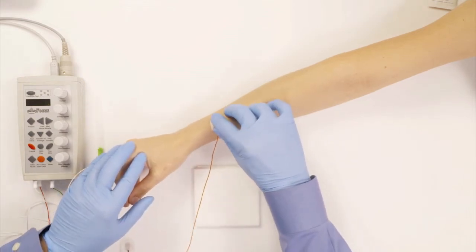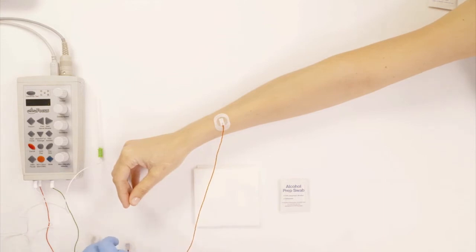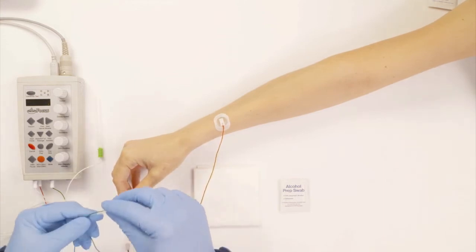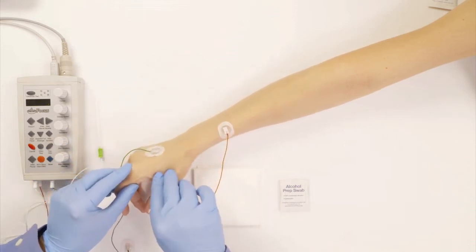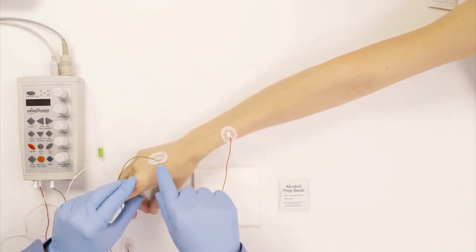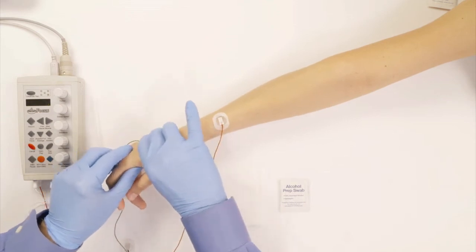And for the green electrode, the ground electrode, I'm going to put it somewhere right here on the back of the hand, essentially. That's what it looks like on the back of the hand. So you really won't see it during the test, but it is right there.